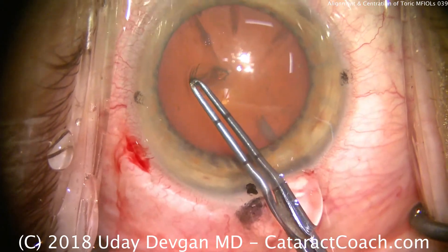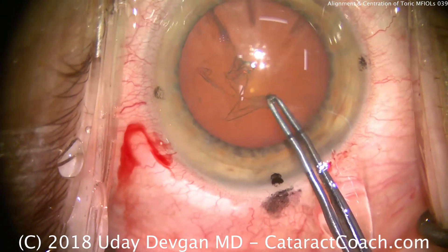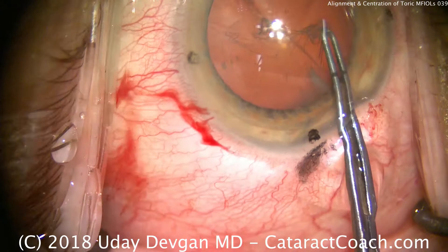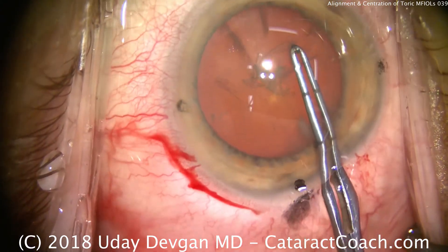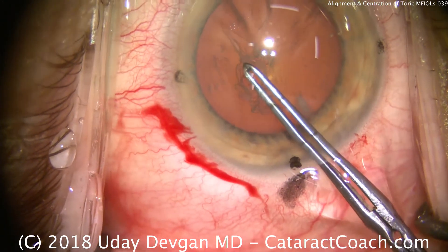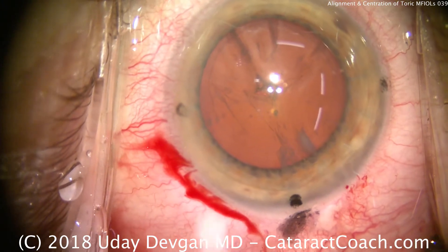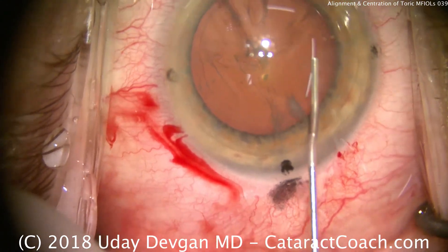We'll poke in here with the forceps and create our round capsulorhexis. It's important to center the capsulorhexis over the visual axis, so that means making it a little bit wider nasally, as we're doing now, than you'd anticipate — you'll see why at the end of the case. That's just about perfect; the light reflexes are exactly in the center of our capsulorhexis.